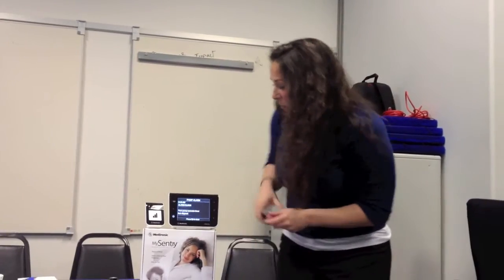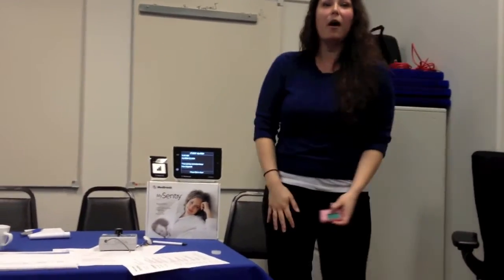And so you can clear it from here, but that won't actually clear the alarm. It'll just clear it for 1 minute because the alarm will be sent to the mySentry every 1 minute until you clear it on the pump. So you have to actually clear the alarm on the insulin pump for it to go away on the mySentry. That's a safety. Exactly. And so to Carrie's point, that's really a safety feature, because we hit snooze alarms and don't get up, basically.